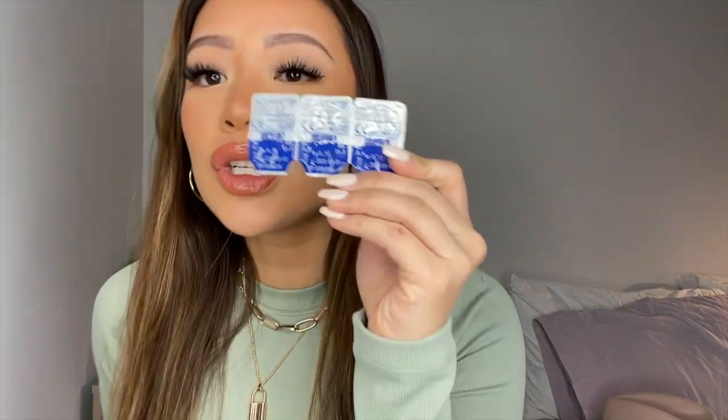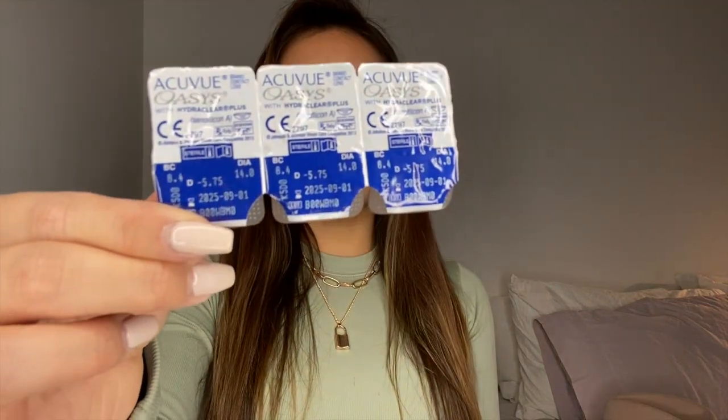Yeah, Acuvue Oasis bi-weeklies, and then there is one more, I think it's Pro Clear bi-weekly. Personally, I haven't tried those, but Acuvue Oasis, I've never had issues with these. I'm currently using them right now. I switch back and forth between the dailies and the bi-weeklies depending on what I'm doing in the day, but I wear these religiously, and I don't have too many issues with makeup residue on the lens if I'm careful with my application. But if there's makeup on them, they're pretty easy to clean with an all-purpose saline.